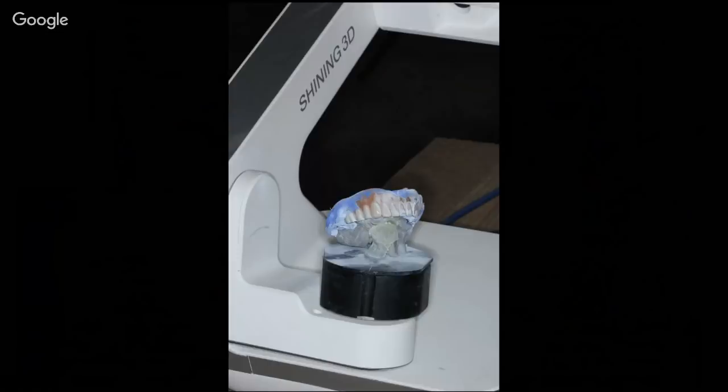Now, it's most important that I capture the internal surface of the denture. Because there's not really a good holder that I'm aware of that can hold the denture upright for it to see inside of it, what I do is I just use some Triad gel. If you see this little pedestal that I've created, think of this almost like a sprue. This is going up and connecting to the denture, and the denture is entirely disconnected from the build plate so that this scanner can see the internal of the denture everywhere. And then really I just need to pick up enough of the buccal surface to let the software stitch those models together.